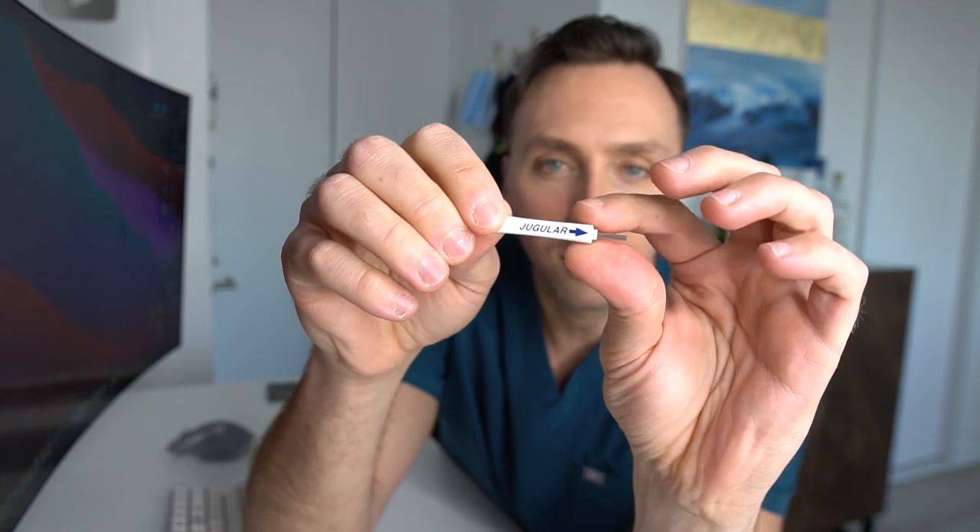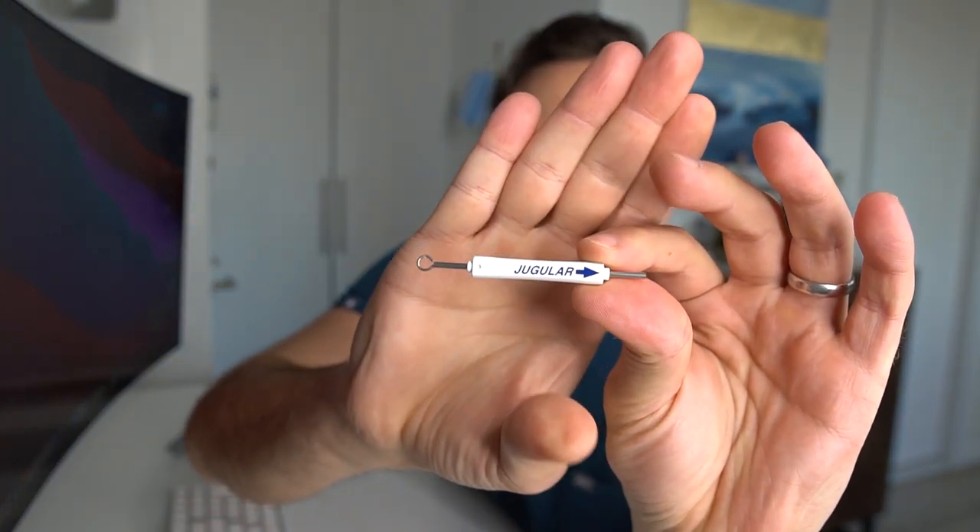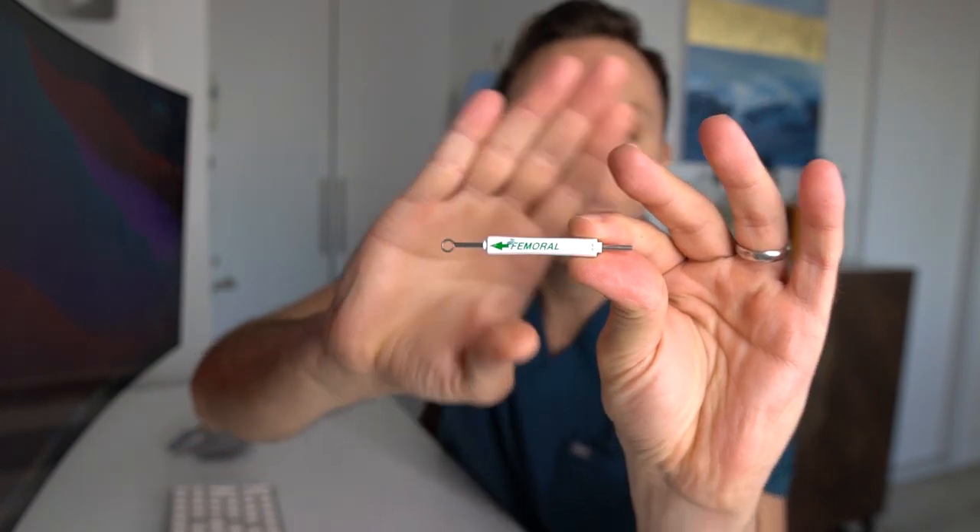Now let's get to the unsheathing of this actual IVC filter. There's a jugular side and a femoral side — you place it this way if you're doing a jugular approach, or with the arrow pointing the other way for a femoral approach. The filter ends up in the same position regardless; you just need to expose it in the correct orientation, because you don't want an upside-down filter from placing it in the wrong direction.